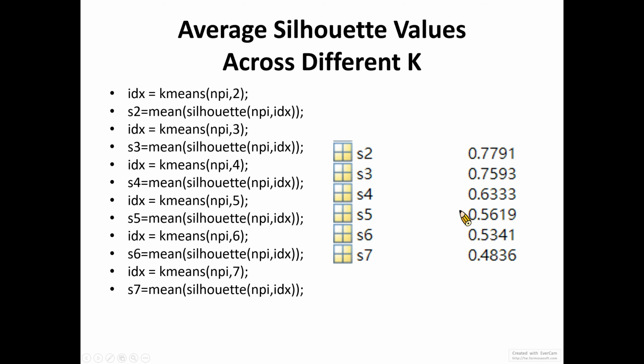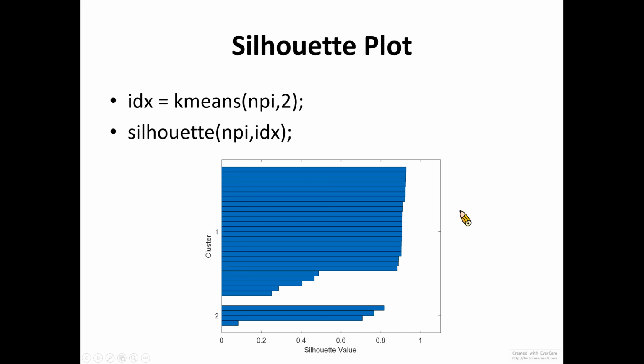Okay, so you can see that in this silhouette plot, we can derive the similarity of each data point to the others within clusters.